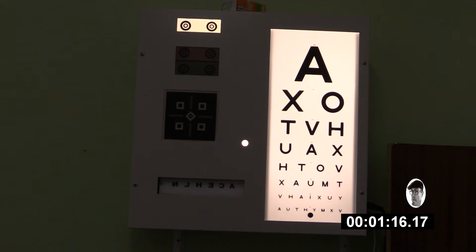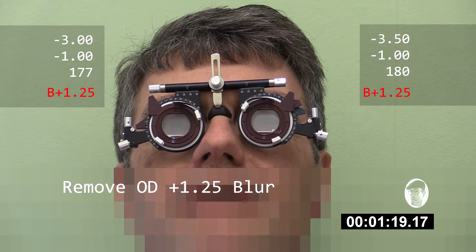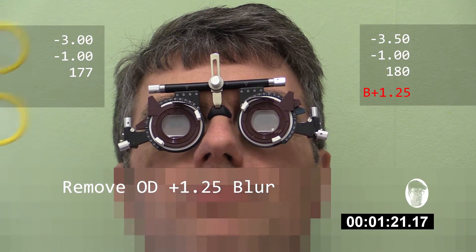Okay, if I take that out there, is it back down towards the bottom? Towards the bottom, yeah, so one from the bottom. Yeah, yeah.